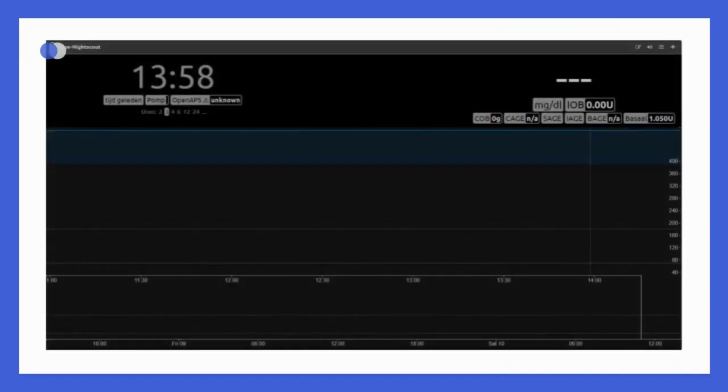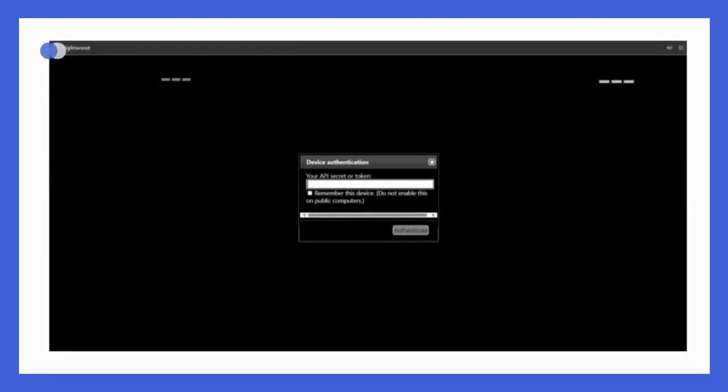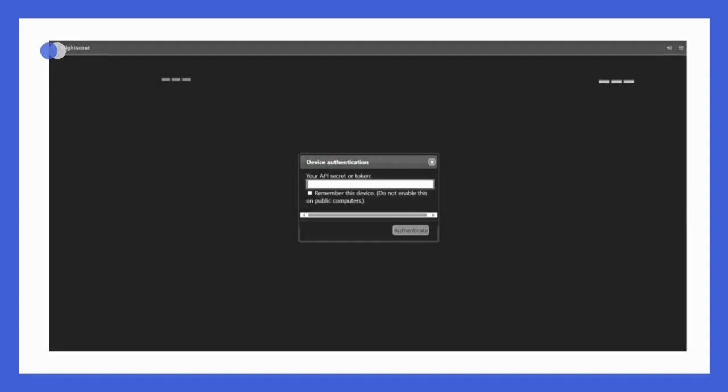To use NightScout, you'll need to set up a personal NightScout website. iAPS can send the data to your NightScout website, allowing your healthcare provider to access and review your reports in real time. Caregivers can access the data on the personal NightScout website, ideally with a token. This allows them to view and track your insulin and glucose information and stay updated on your diabetes management.